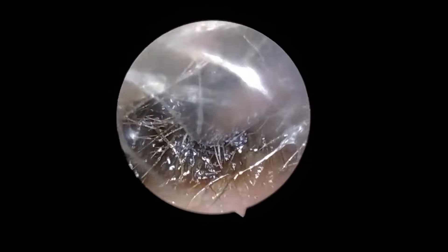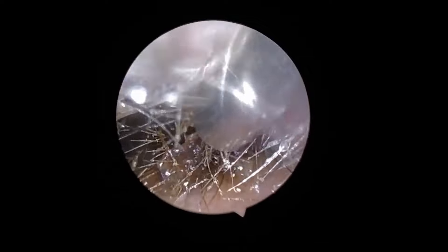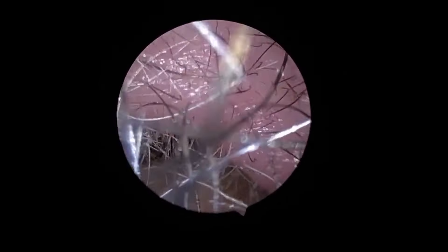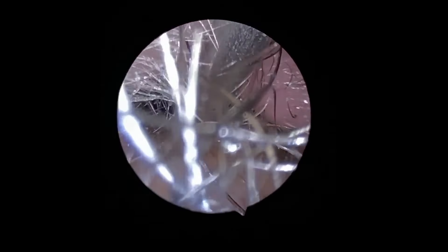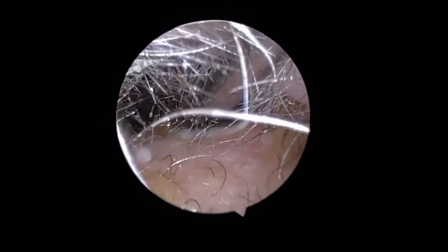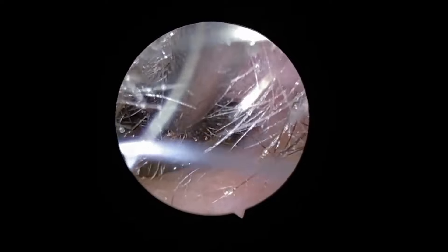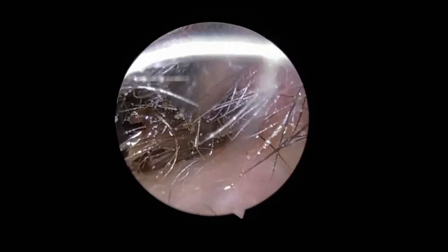So here we begin. In goes the probe — a standard sized Zollner — and you can see that the end of the tube holds onto the surface of the plug straight away. But because we run into the same oily problem, I remove the probe and clean the end with a wipe again. When I go back into the ear canal, the hairy partial blockage attaches to the probe and we are out.